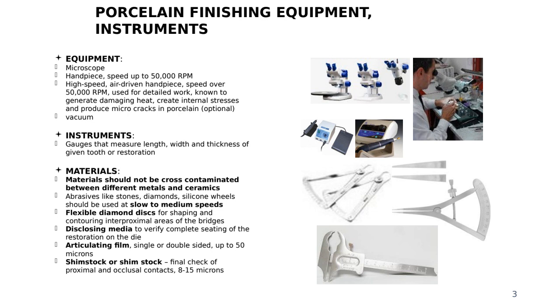Handpiece, right? So we need a handpiece. And we're going to use it from the beginning of the case till the end. In the beginning, we use it to cut the dies, to trim the dies, to base the dies, do all that fun stuff. And at the end, we're going to use the handpiece to polish. Good. High speed is a good tool to have.